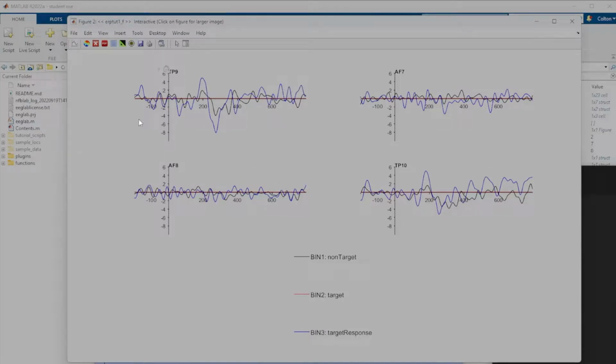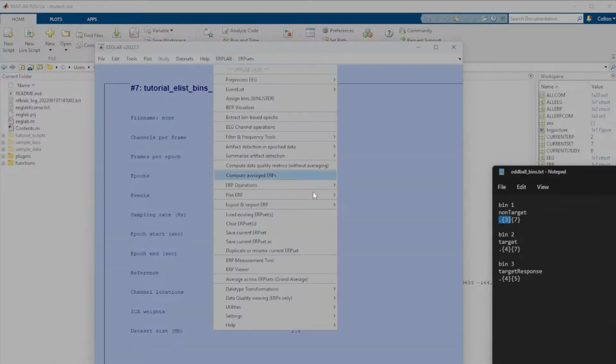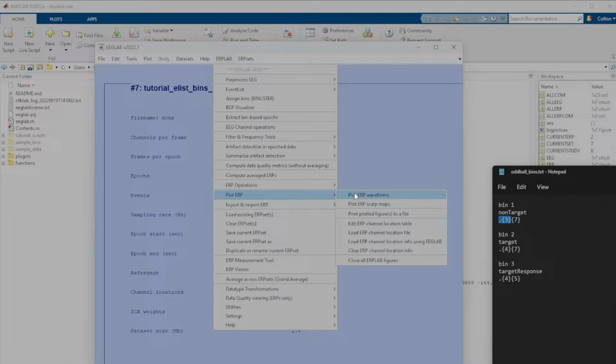And if we look here, it will appear to be incorrect, right? So TP9 and TP10 actually appear to be upside down. We should have a P300, but it's actually looking like an N300. So what happens is on the Muse, the amplitude is actually flipped upside down, because FPZ there at the front is used as the reference. So any electrical data reaching FPZ is going to be projected negatively to the other electrodes, since the voltage is the difference between the reference and the selected.